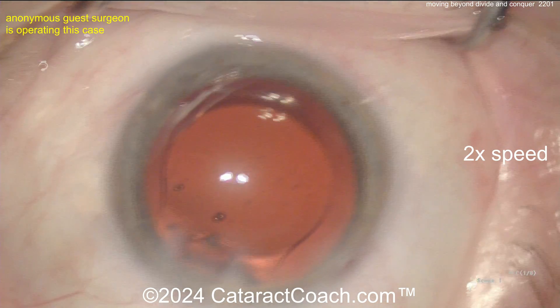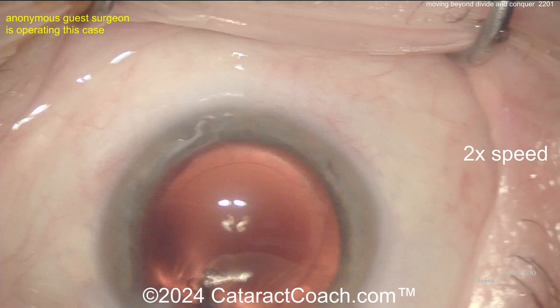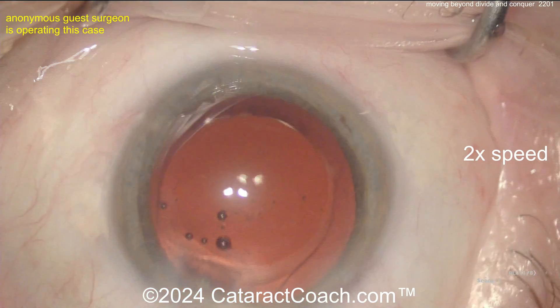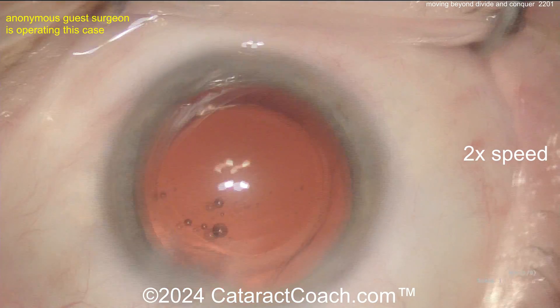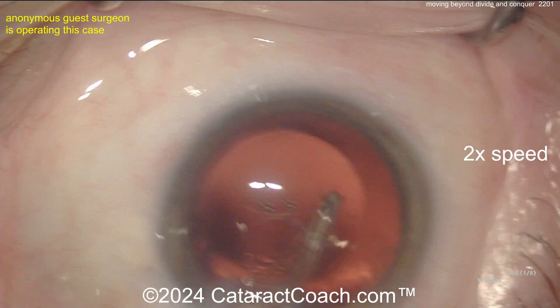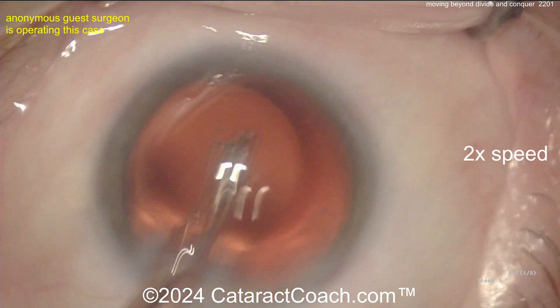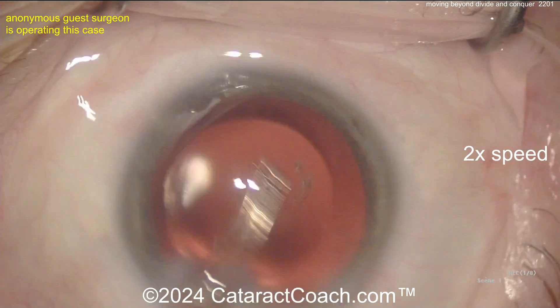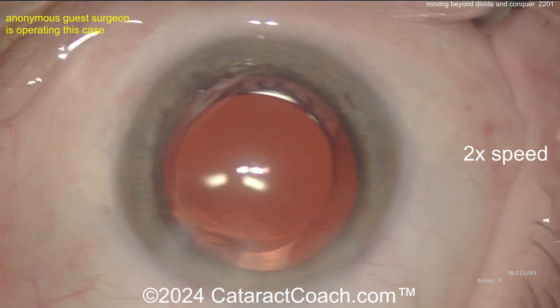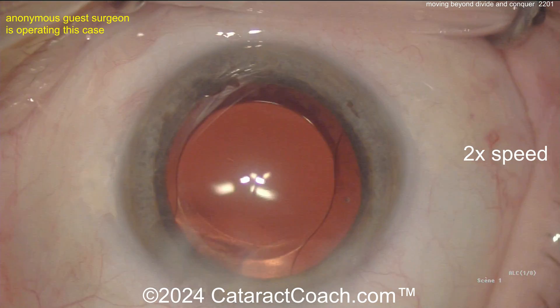You definitely have to advance the stop and chop. You tried your best here — I do appreciate that. Thank you for sending the video in; as you know with all these resident cases we keep it totally anonymous. Plan on accomplishing a beautiful stop and chop and once you do that, send another video in. Now let's see — is there any cortex left in the bag? Looking sub-incisionally — maybe that's just the way the incision looks, but the lens is in the bag and looks pretty good.